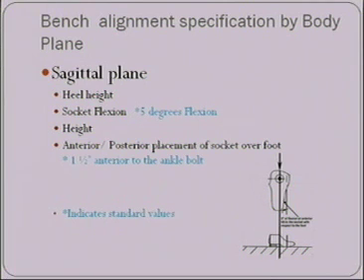The thing to remember with that is the practitioner is taking the measurement most likely without a shoe on, and the heel is touching the floor, and so it's the same distance. But when we add the heel height in there, we have to raise it up and add that heel height in to the measurement. So we always want to measure from the heel of the prosthetic foot to the MTP level when you're measuring for height.